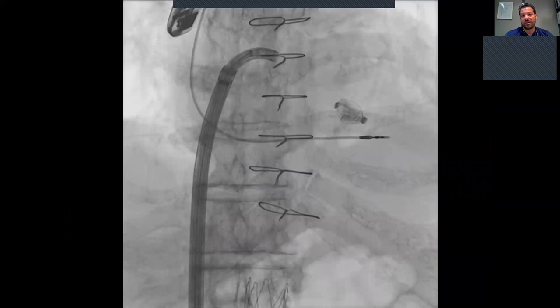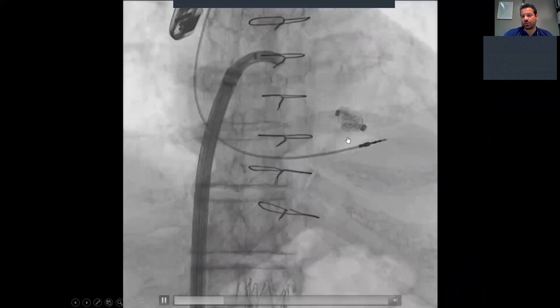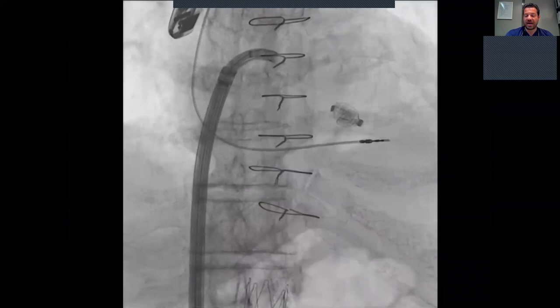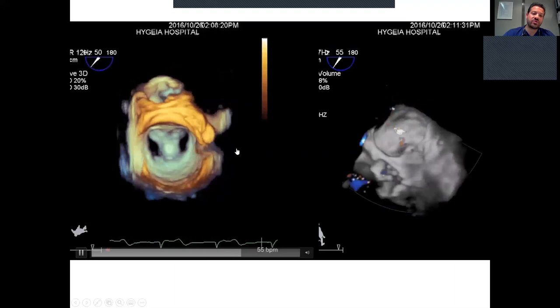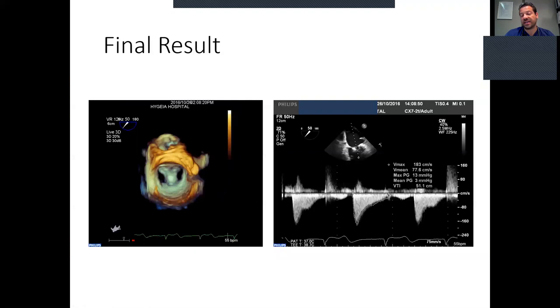In the fluoroscopic view, a stable device confirms good grasping. If there is a single leaflet detachment, you will see an unstable, freely moving device. Finally, we check the bridging between the anterior and posterior leaflets; a double orifice mitral valve with nice bridging represents a very good result with mild regurgitation. Before releasing the device, it is important to measure the mean gradient of the valve — if the mean gradient is above 4 or 5 mmHg, that indicates iatrogenic mitral stenosis, and we must retract the Pascal and not complete the implantation.